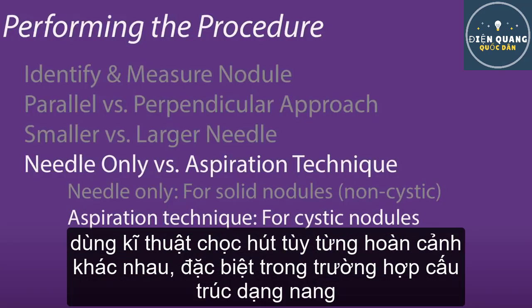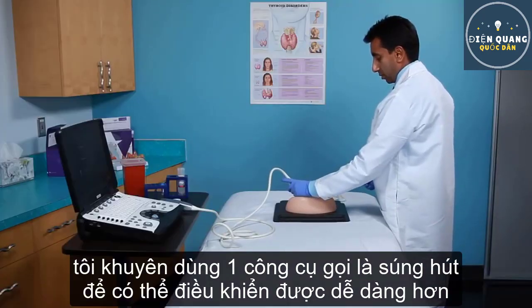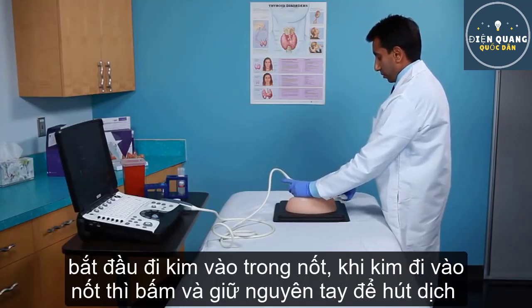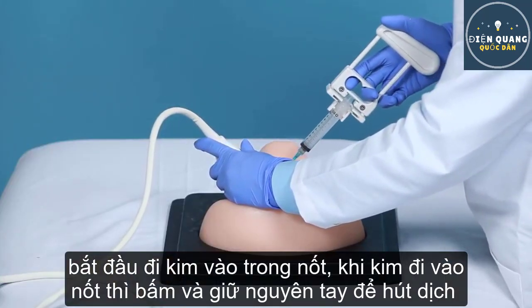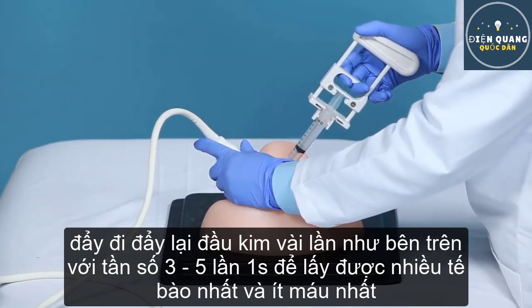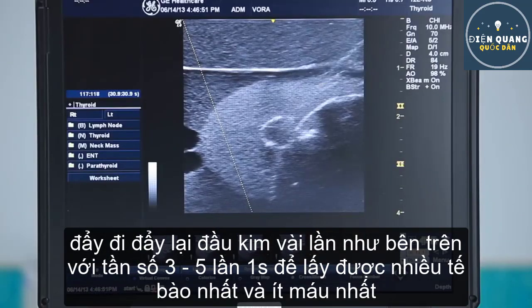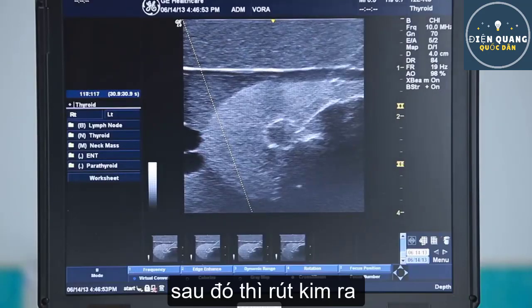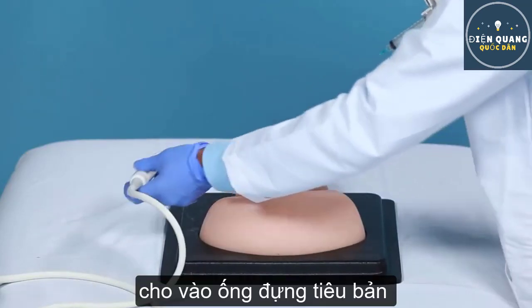Use the aspiration technique in circumstances where non-aspiration produces inadequate samples or for cystic lesions. It is recommended that you utilize an aspiration gun to allow more control during the procedure. Advance the needle tip into the nodule and pull back on the syringe to apply suction of about 2 to 3 cc's. Maintain suction as you move the needle back and forth 3 times per second to get the most cells and the least blood. Gently release the suction and remove the needle. Put the sample in the collection tube.